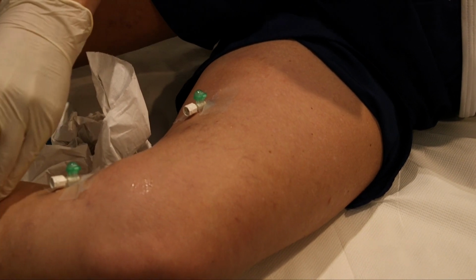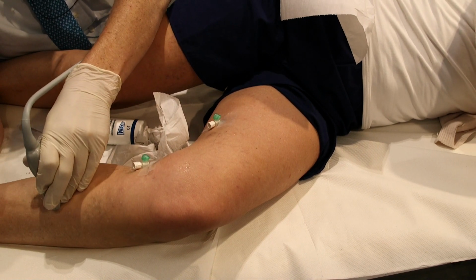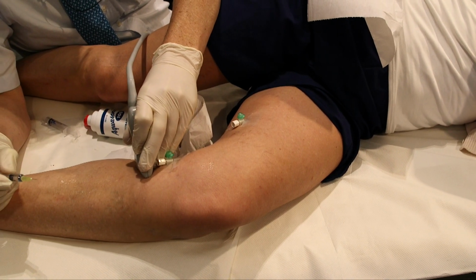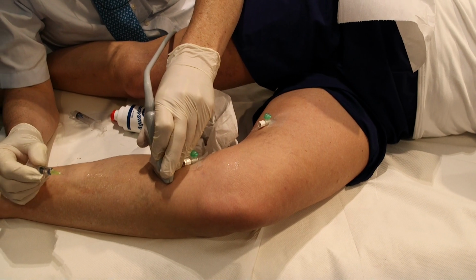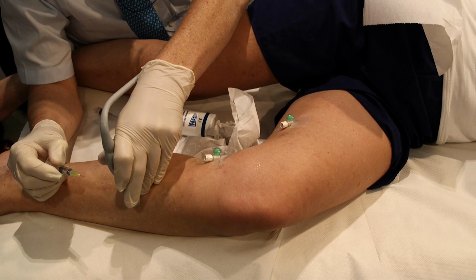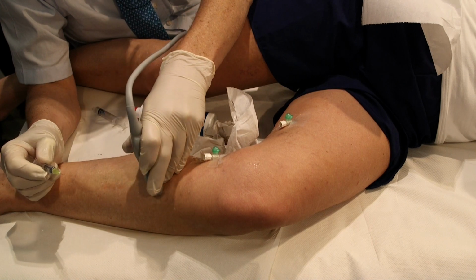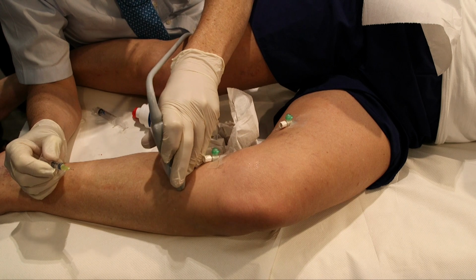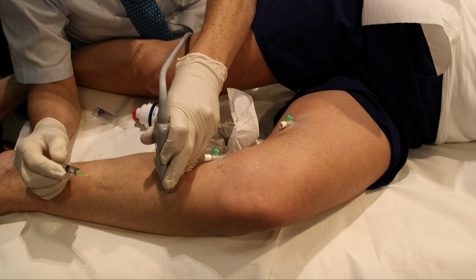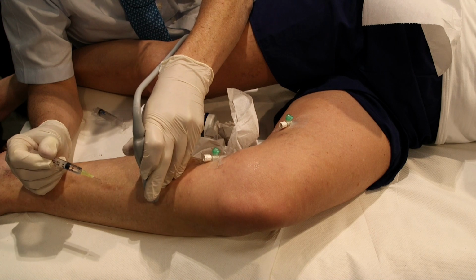And then this is the region of the varices, and again, there is the main saphenous trunk. That in the middle of the picture is the main saphenous trunk, and it goes off towards the shin. And then we have the superficial accessory vein, where the varicose veins are arising. So again, we need to treat both, and that's where the varicose veins join the saphenous trunk at that point. And then there's a little perforating vein, a paratibial perforator, going down there somewhere.